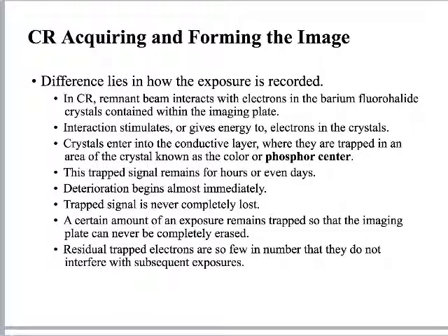In fact, I remember one time wasting a whole package of film because I accidentally left the drawer open and turned the light on in the darkroom. Just a momentary slip of reason, I accidentally turned the light on and ruined $500 worth of film, just like that. With CR, you can leave it out, and the computer is going to clean up all that noise. So that's the power of the computer.